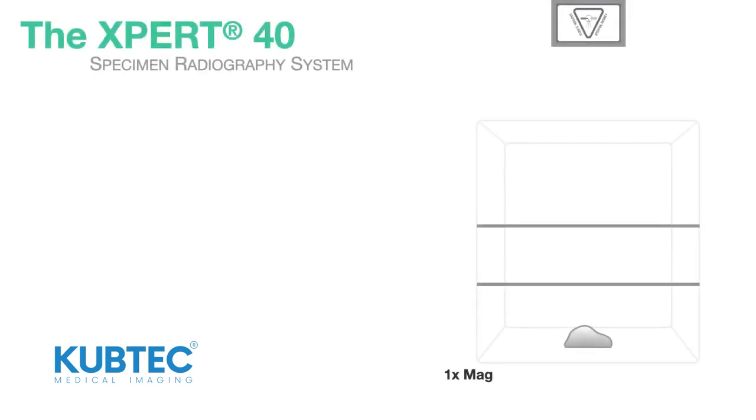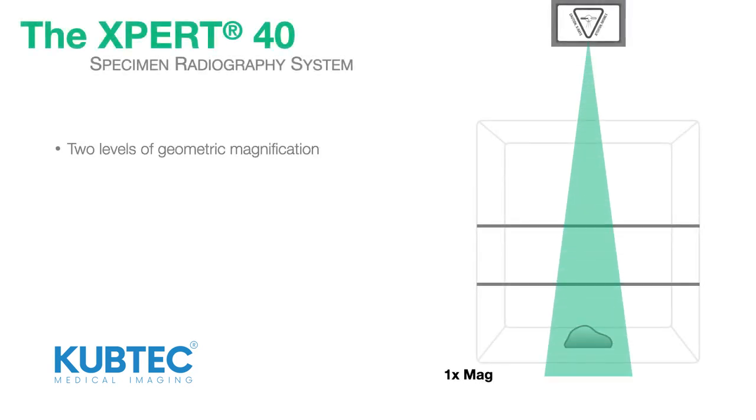The system provides two levels of geometric magnification for increased image detail. Simply place the specimen in one of the two pre-set magnification positions for 1.5 times or 2 times magnification.